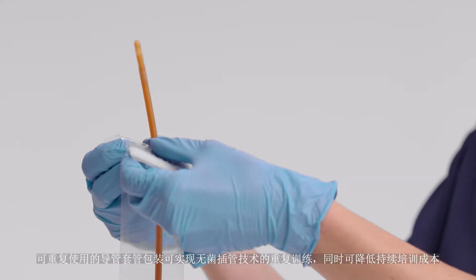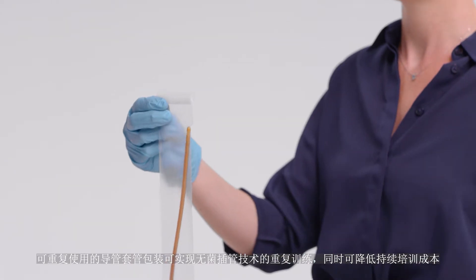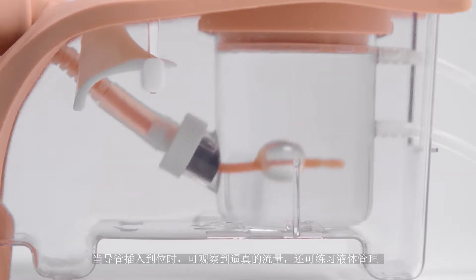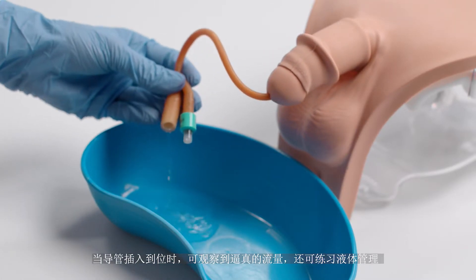The reusable catheter sleeve allows repeat training of the aseptic catheterization technique whilst reducing ongoing costs. Once the catheter is in place, realistic flow can be observed, allowing for practice of fluid management.